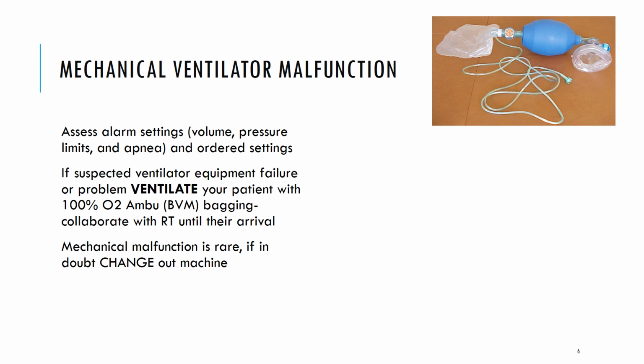So while this won't happen very often, and hopefully it will never happen to you, it's important to remember what our priorities are in this type of emergency. If the ventilator won't work, stop fiddling with it and breathe for your patient. So how is this done? You can see here there's an Ambu bag or the bag valve mask, and notice we have the blue bag that you can squeeze to deliver the breath.